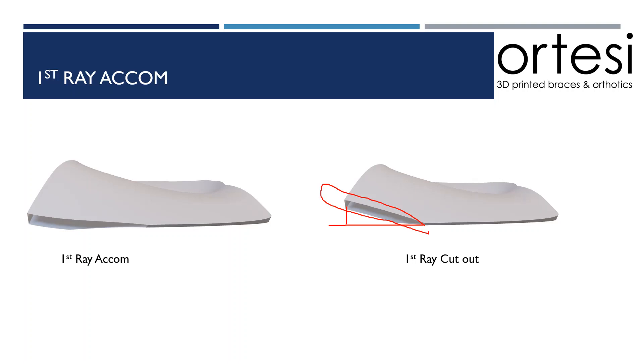A first ray accommodation works in a similar way. It drops the medial distal edge of the shell at a steeper angle and also removes a section which allows that first metatarsal head to plantar flex. However, it does so by bringing the medial distal edge plantar grade. So this is a more stable accommodation to improve first ray function if you're not planning on using any sort of posting.